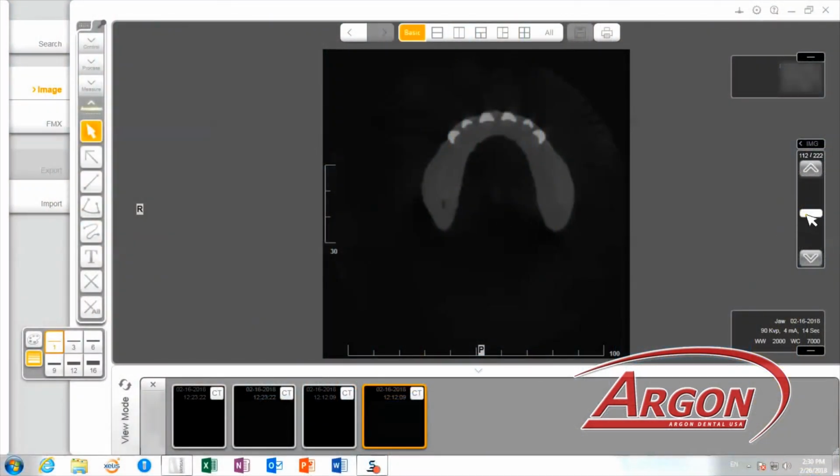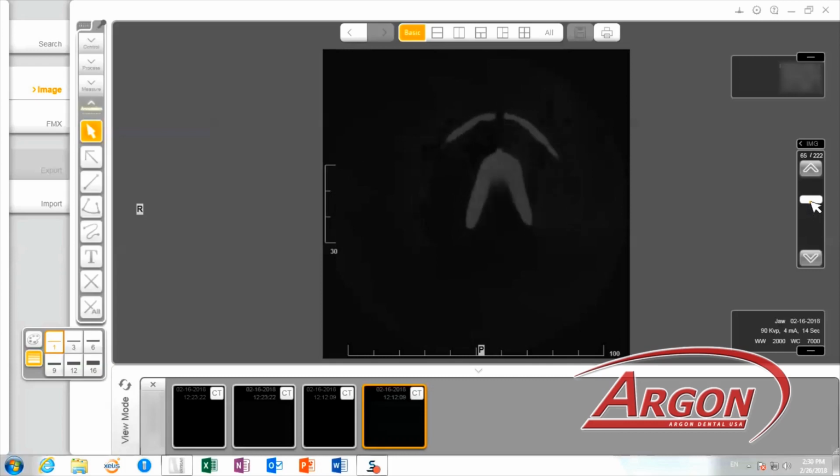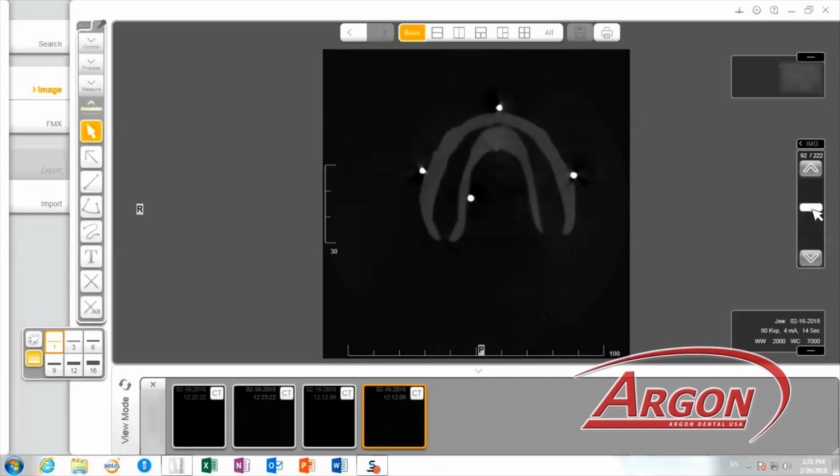Looking at the CT, now you can see the little white dots. Those are the 6 SureMark markers that can be identified. Now we can take that CT scan of the individual appliance and merge it in with the appliance in the patient's mouth.